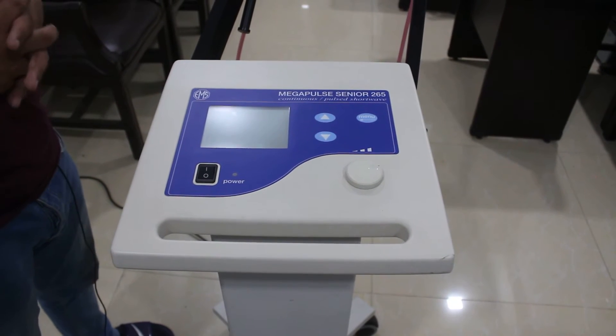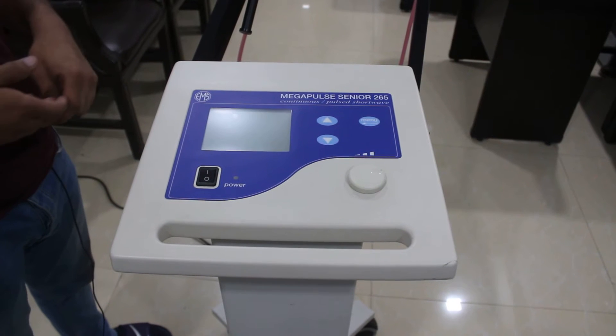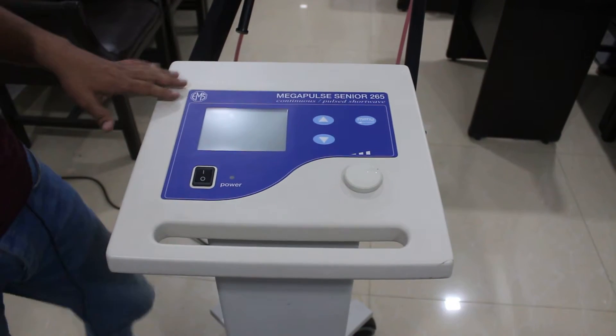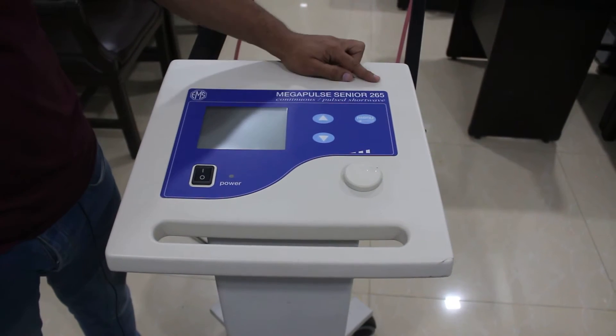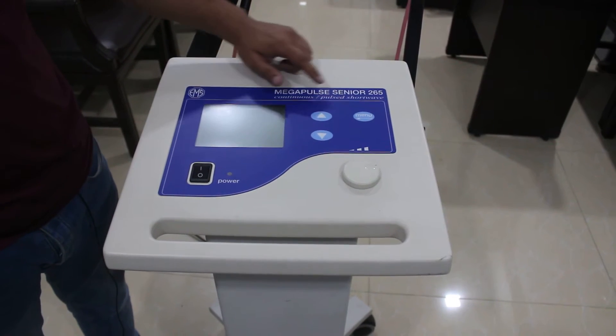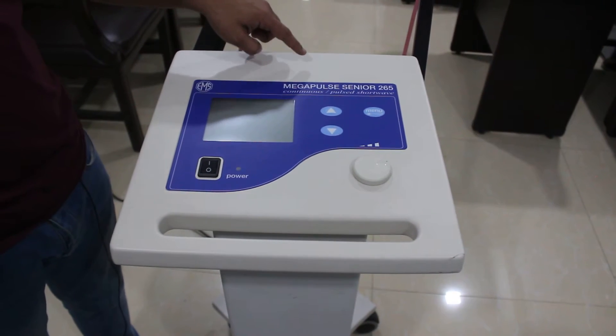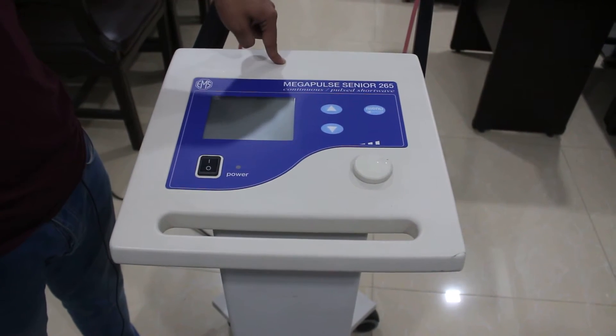Today we'll be demonstrating how this shortwave diathermy machine works. This is the Megapulse Senior 265 by EMS company, and it can produce continuous and pulsed short waves. The working frequency is 27.12 megahertz with an 11-meter wavelength.